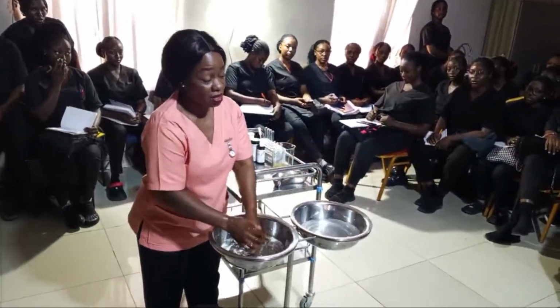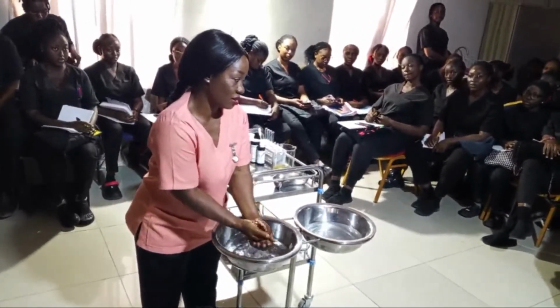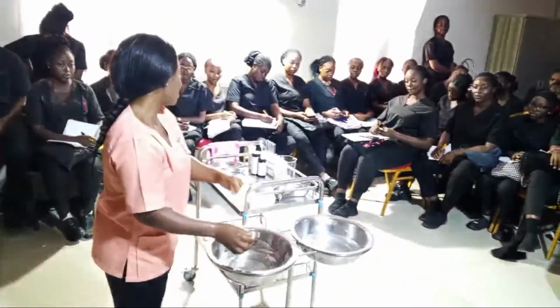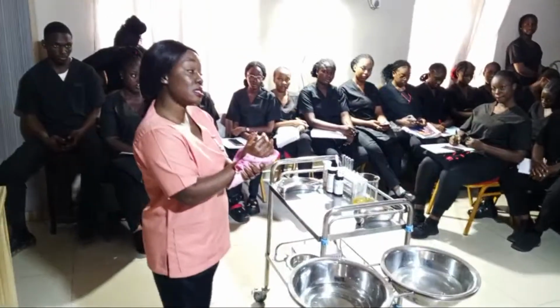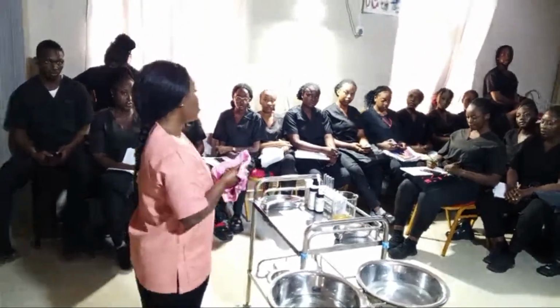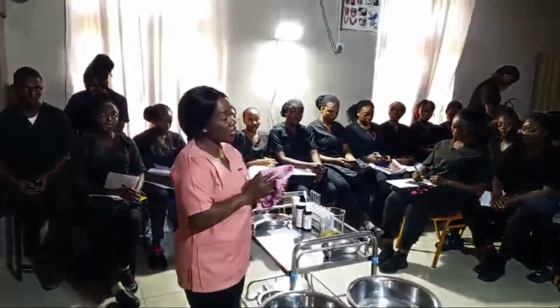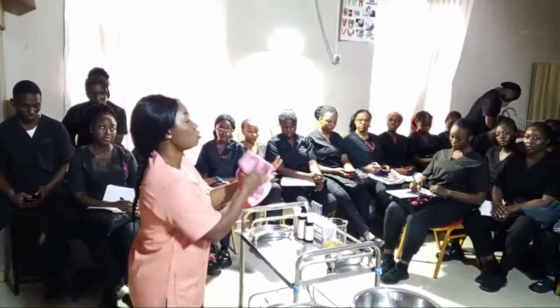Pardon me, I'm not using running tap, so I have to use this water, and I will dry my hands. Don't forget, it is important for you to dry your hands, right? It is important for you to dry your hands so that when you are putting on gloves, you will not have issues. The glove will not be sticking to your hands.